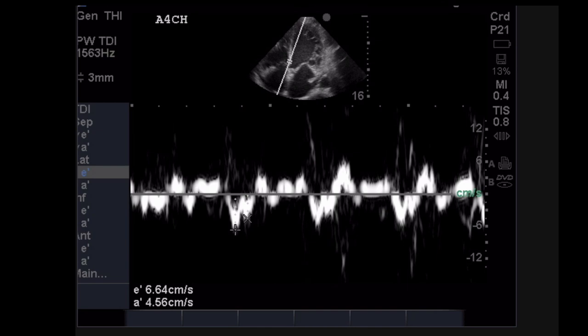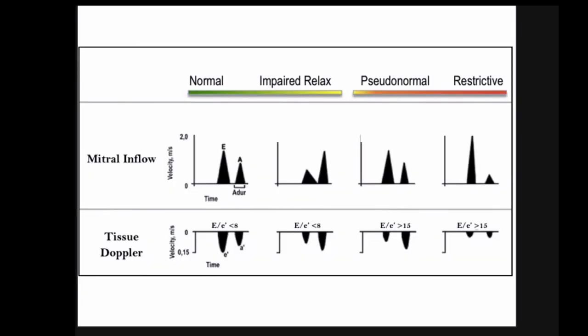E-prime and A-prime are the same concept — LV relaxation velocity should always be greater than the atrial kick velocity on tissue Doppler. You can take E-prime and A-prime at the septum or the free wall. These two numbers are how you get to grading diastolic dysfunction.